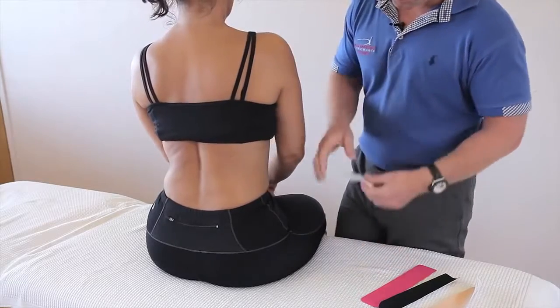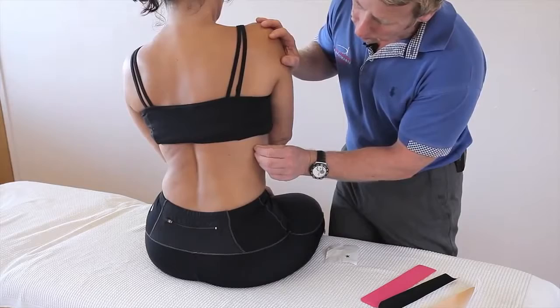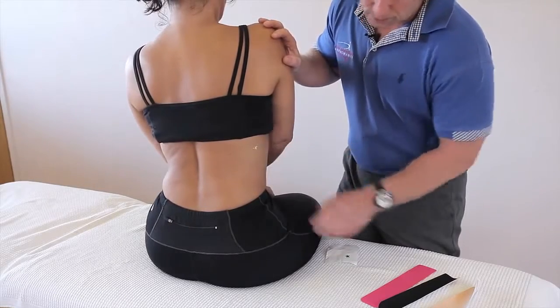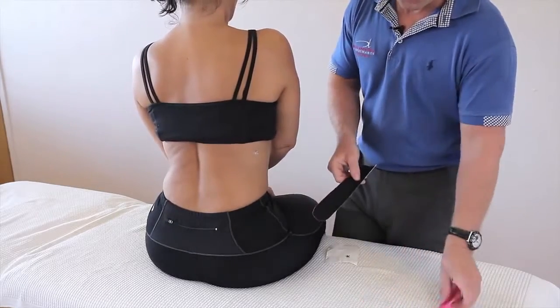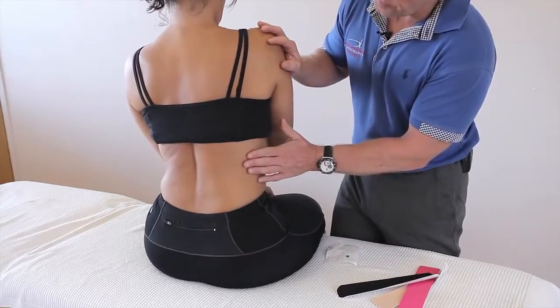If I just mark the area — let's say the patient has pain around this area just here — then we're going to use three prepared I-strips that have the ends rounded off to try to offload this pain.